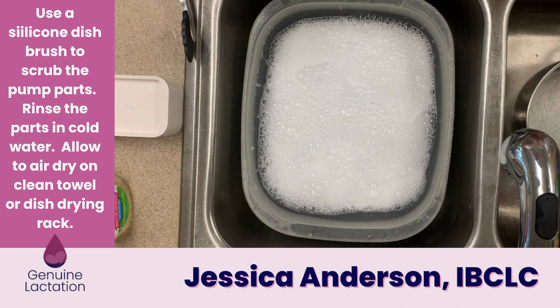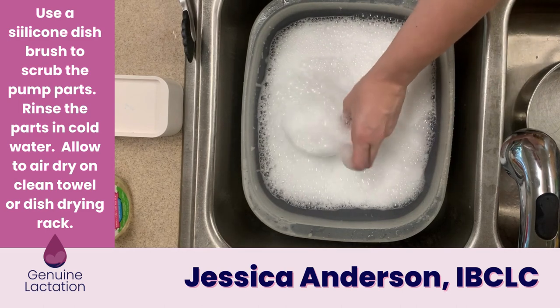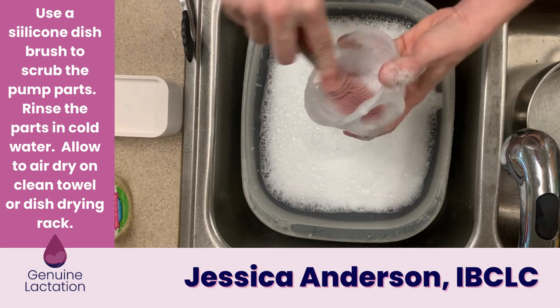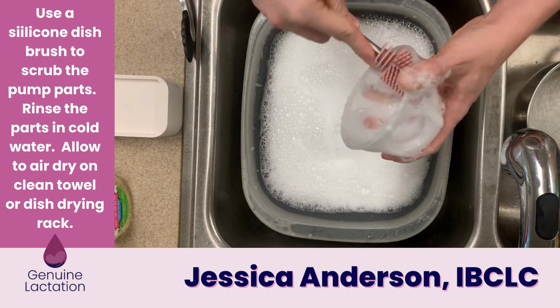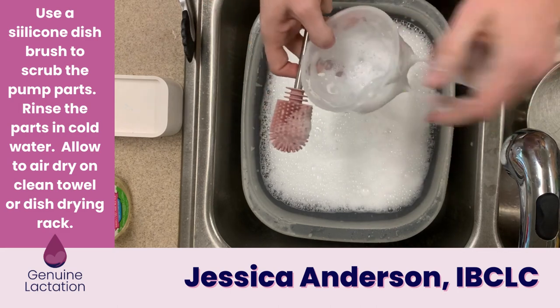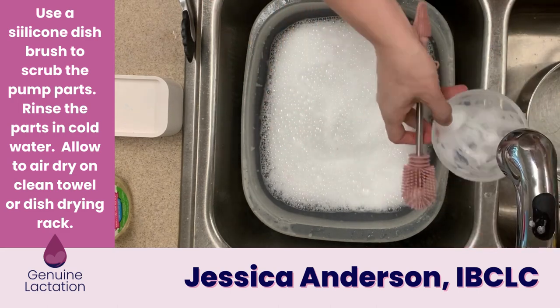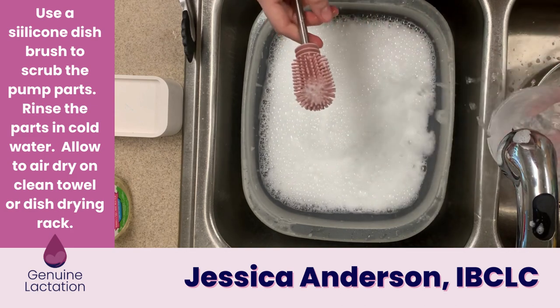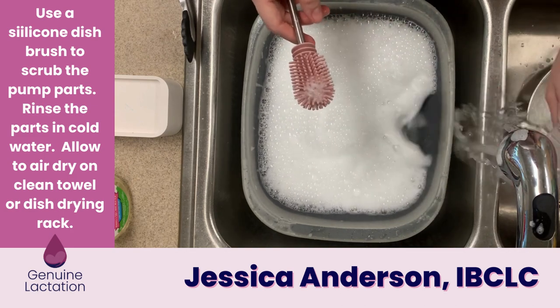After soaking for about 15 minutes, pick up the parts — making sure the water is cool enough to touch — and use a silicone dish brush to clean all of the surfaces inside and outside. Then rinse the part in cool water to remove all the soap, and set it aside to dry.